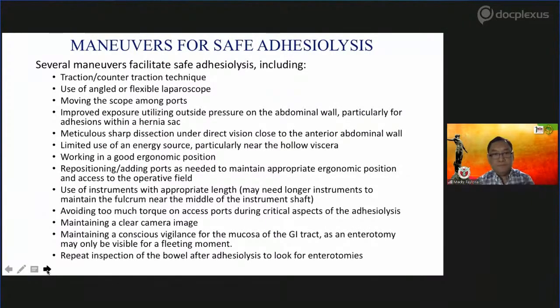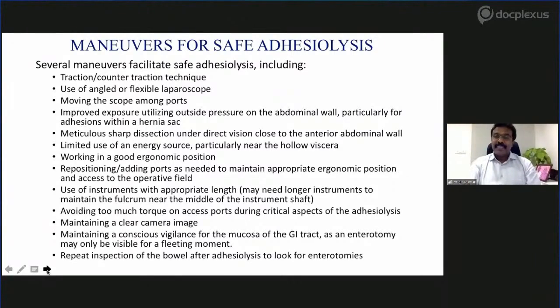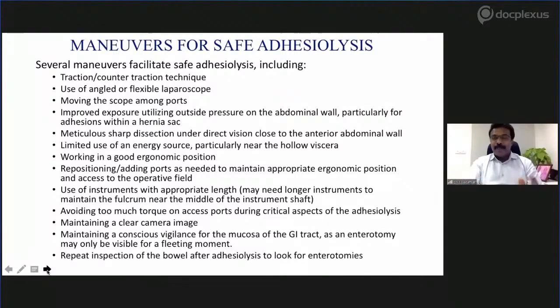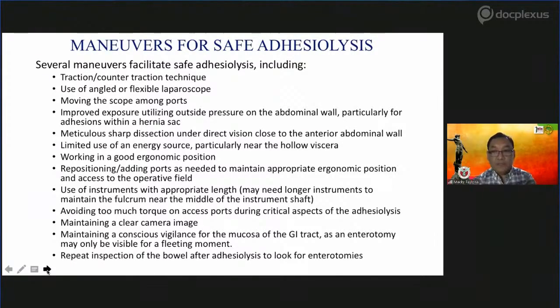Exactly. Any other opinion, sir? Don't tell, like Dr. Shiva, that I am an initial surgeon and I want to use a harmonic scalpel or a vessel sealing system here. Just use whatever the doctor told: a scissor without any cauterization. That's all. And you have to make sure that you use the proper instruments in grasping your bowels, because you don't want to make a lot of serosal tears if you are too rough in handling the bowels.